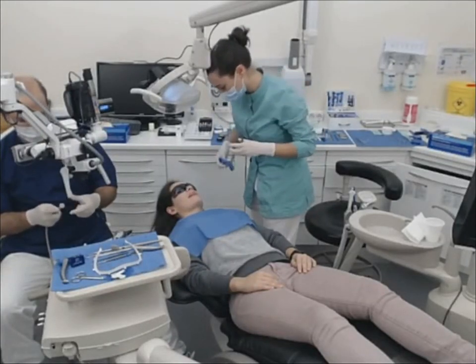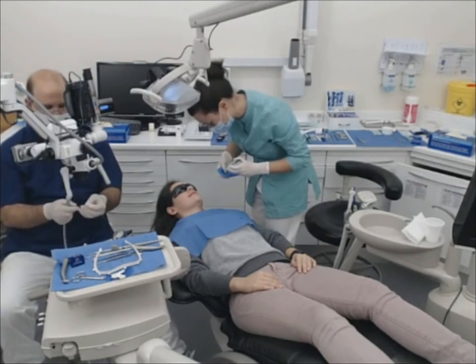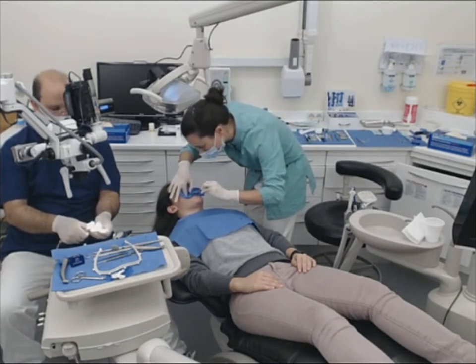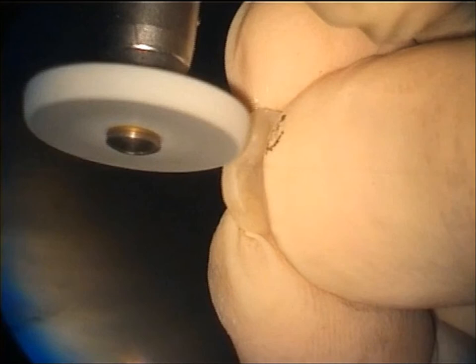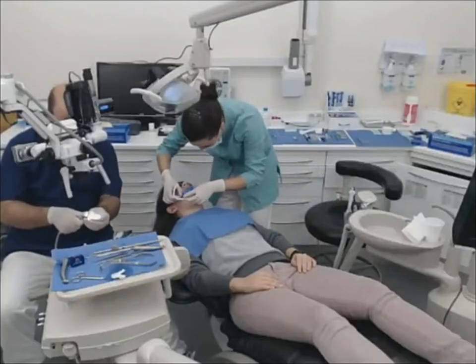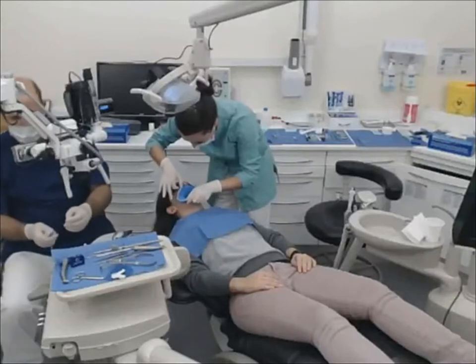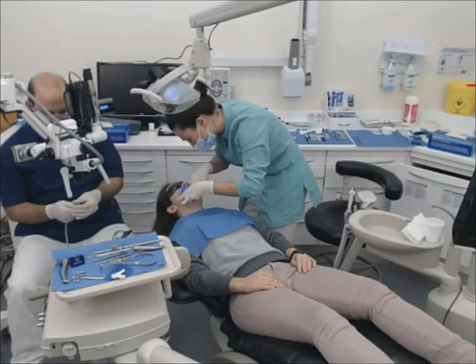The end piece. Okay, I think now it's okay. And I just remove, like you see, very easy to remove them, just put it smooth. Okay, to get a little bit more. That's okay. So I just get the sprue, and now I'm gonna start with the polishing paste.